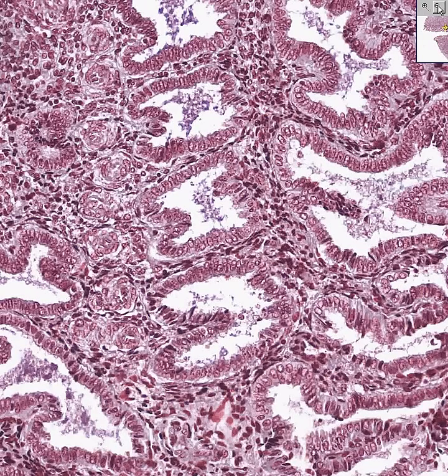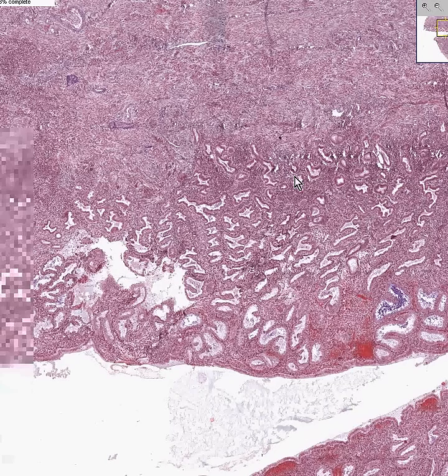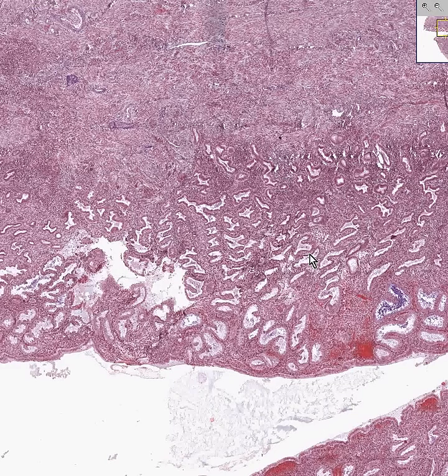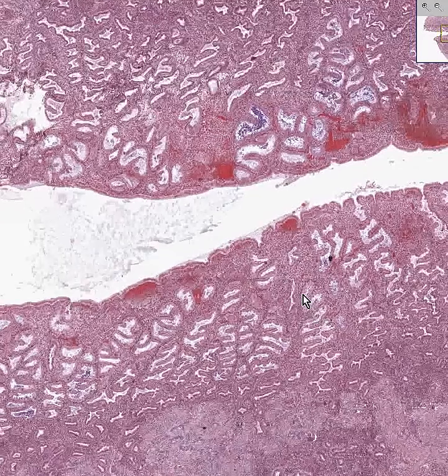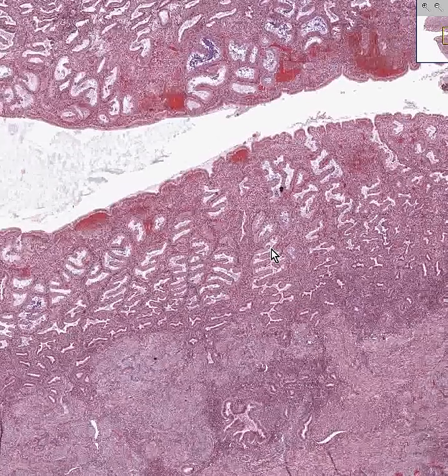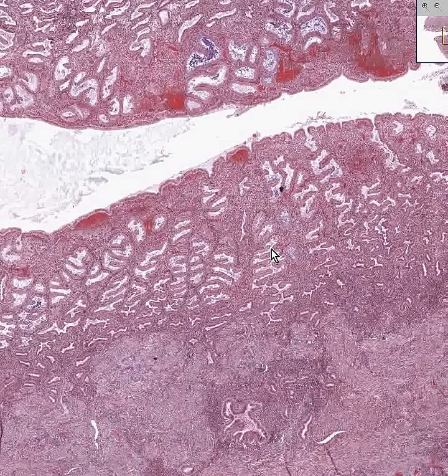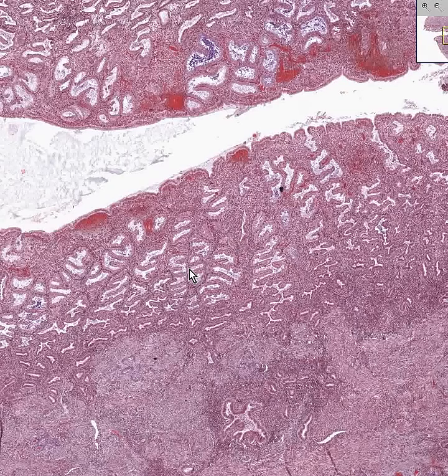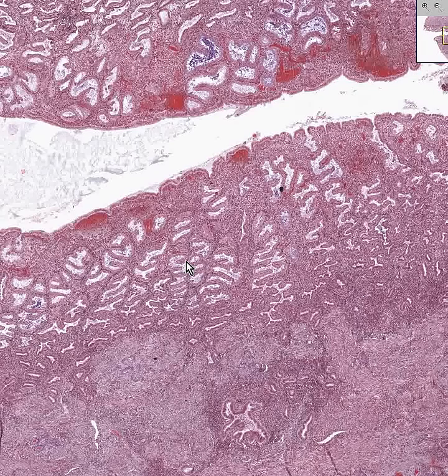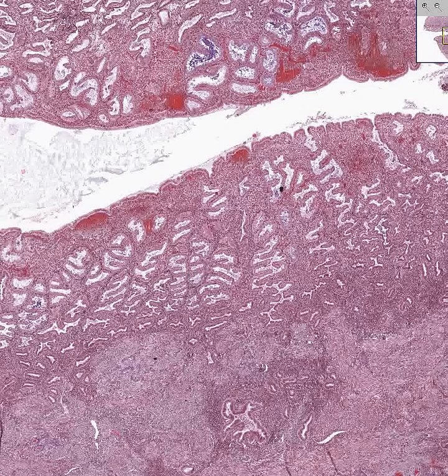This is a classical secretory endometrium, also called post-ovulatory endometrium, also called the luteal phase, primarily under the influence of progesterone. Thank you very much.